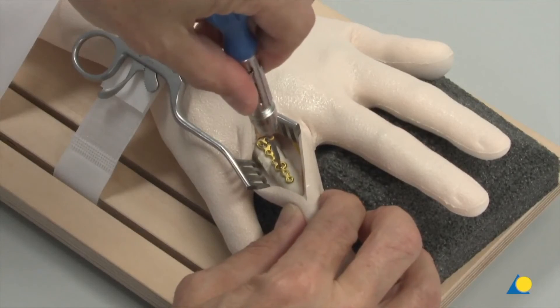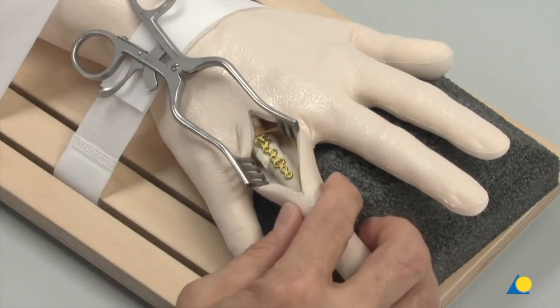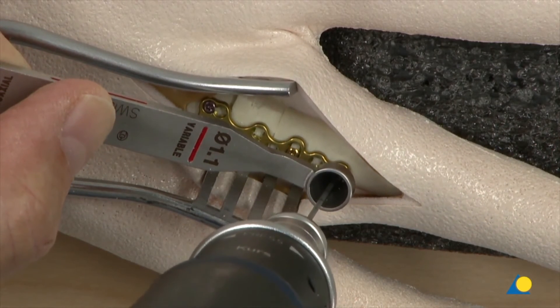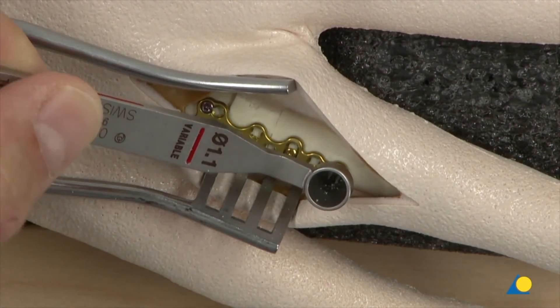After correctly positioning the fragment, the screw is fully tightened, which can provide axial compression. The most distal plate hole will be filled with the variable angle locking screw using the 1.1 variable angle drill guide and the 1.1 mm drill bit.